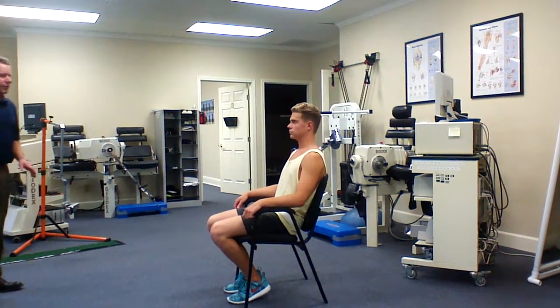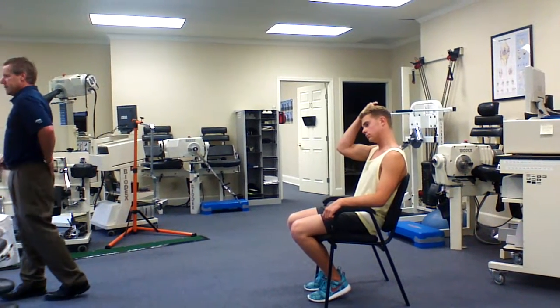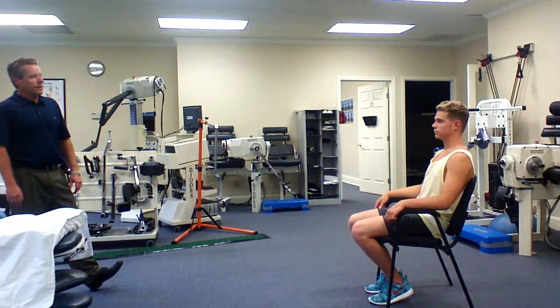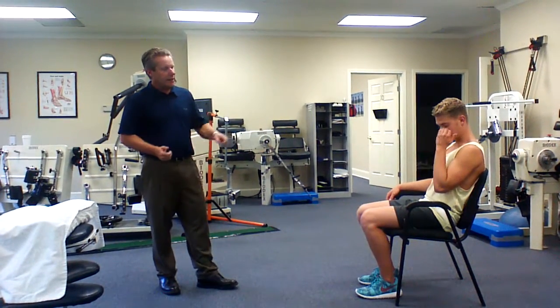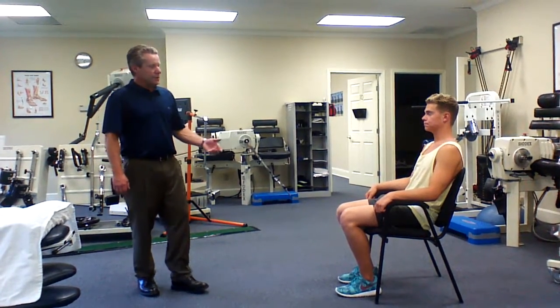What most people report is that it just feels like it kind of ties everything together, and it should make you want to sit with a little bit more of a neutral spine. I usually will tighten it up a little bit too much at first, just so they get the idea of what's supposed to be happening. But keep in mind it's kind of like tying your shoes too tight — if you left it that tight for about 15 or 20 minutes, it would be too uncomfortable. Some people sleep with them on, but I recommend wearing it during the day, especially during seated activities, until you don't need it anymore — but keep it around the house just in case.